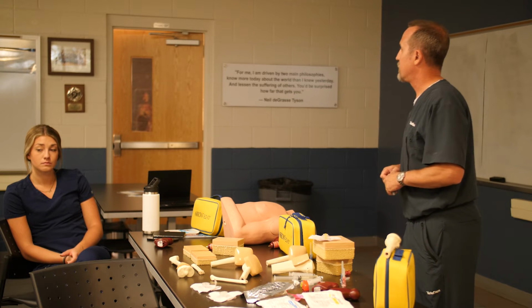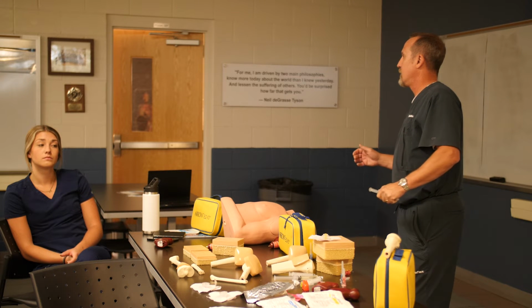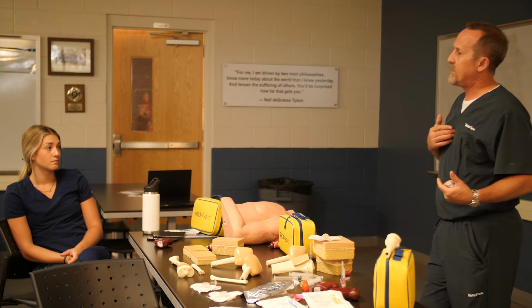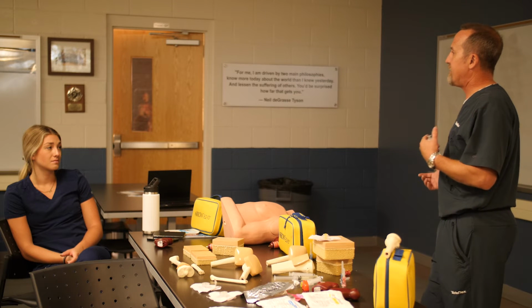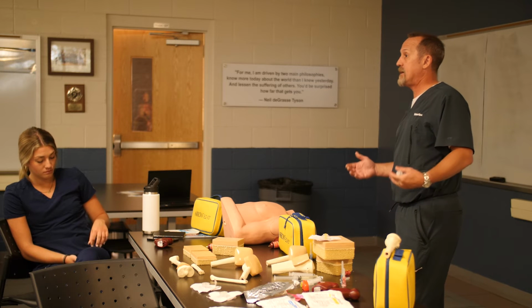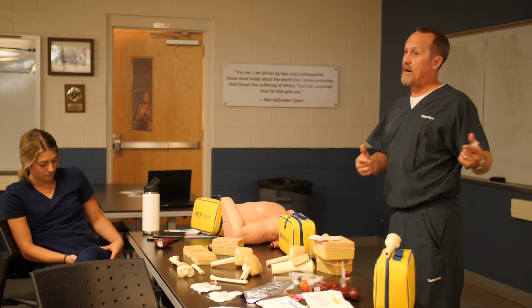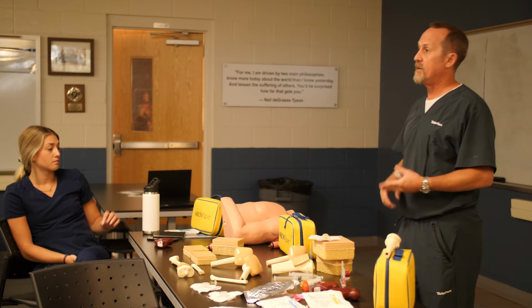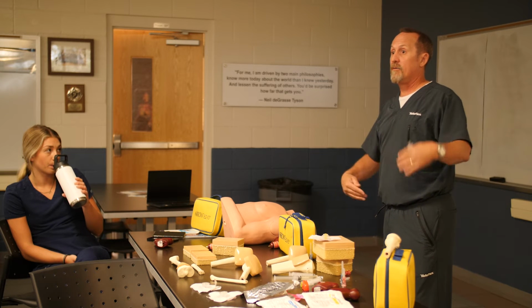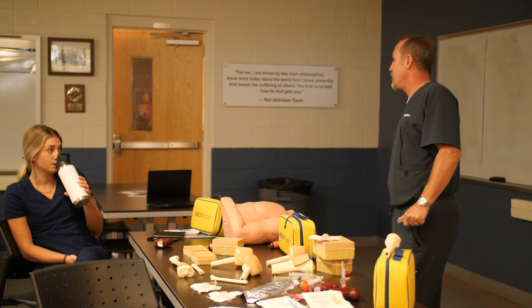Yes, ma'am. We'll probably get the question on why the sternum is not a preferred site. Do you have reasons why we don't go there? So from what I gather, I think that the sternum placement was actually kind of invented in the military. And when you think about combat situations, their job is to stop the bleeding and get fluids in and get them out of there. They don't resuscitate, they don't do compressions, they don't do anything like that. The sternum is a great shot, they can boom and shoot it in, pack their wounds and get them out of there. I don't know, you may have some more insight on that.